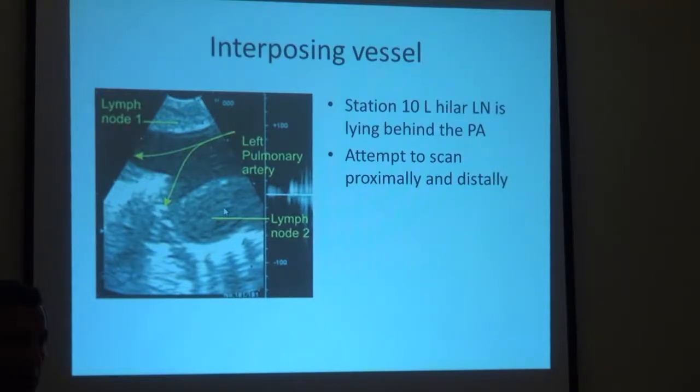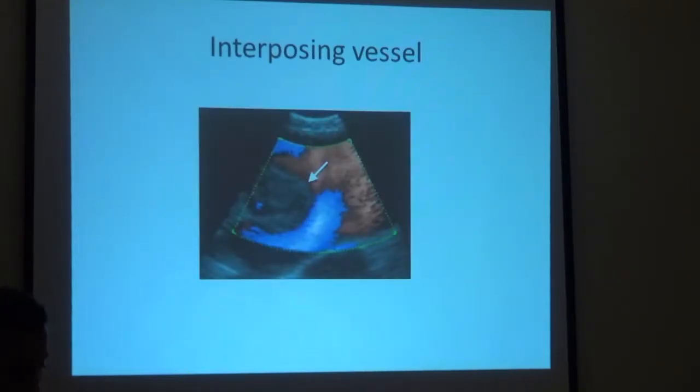After I went in, I said, sorry, I can't get to it except going through the pulmonary artery, which I didn't want to do. And this is just the same image with a Doppler showing you how the lesion is all surrounded by blood flow.